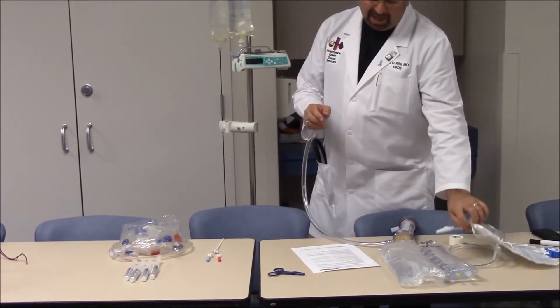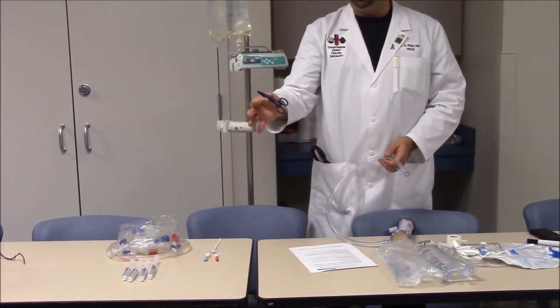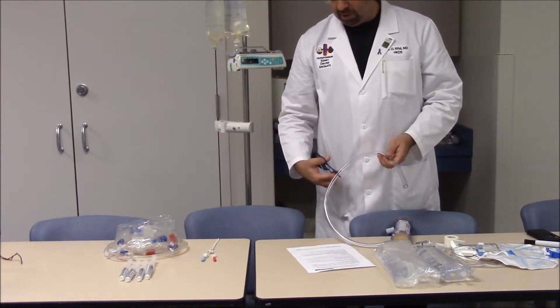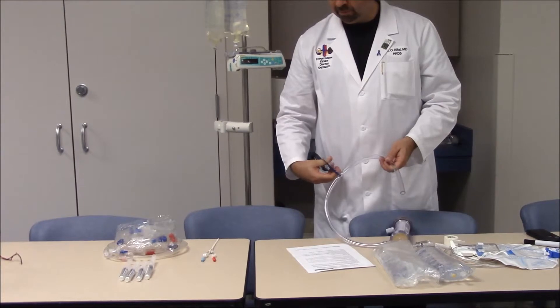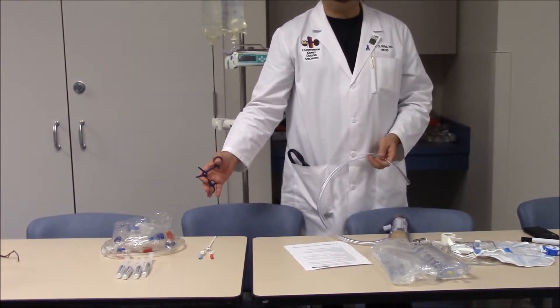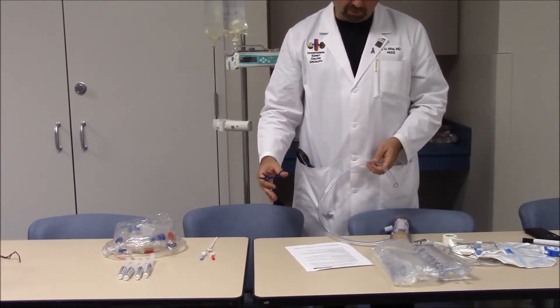We will also need a hemostat — a special dialysis hemostat — which we can use to clamp the tubing used for priming and the extracorporeal blood circulation.